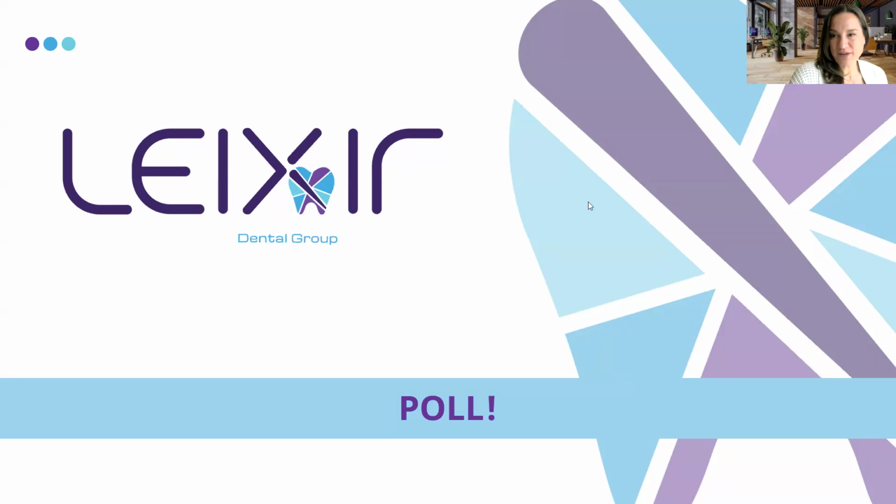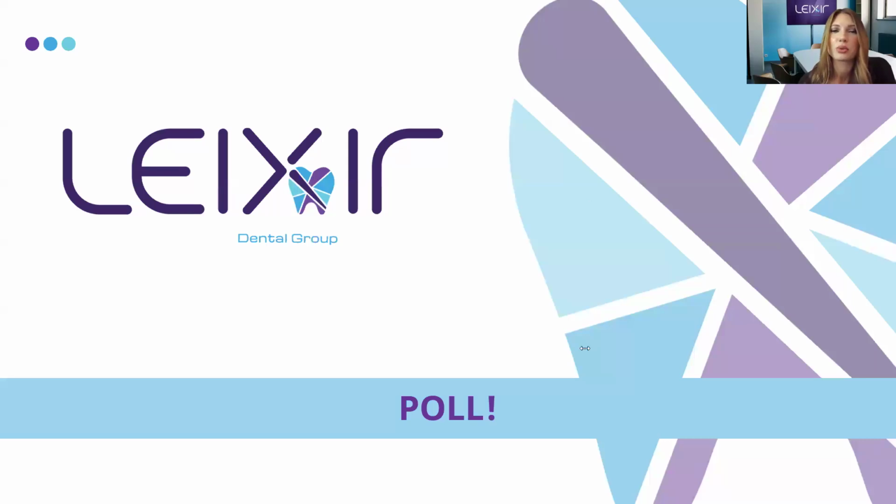All right, I'm going to close it up here and then we'll share the results with everyone. Right, perfect. So the majority got it right. It's that prepped arch segment that we're going to capture the contact data of the adjacent teeth to the prep. Okay. Nice job.